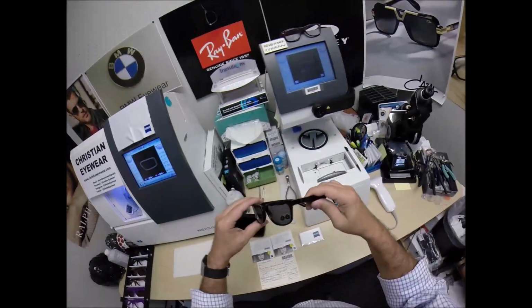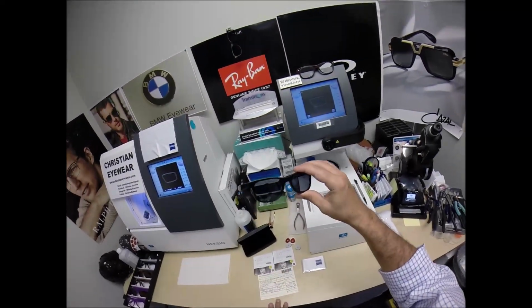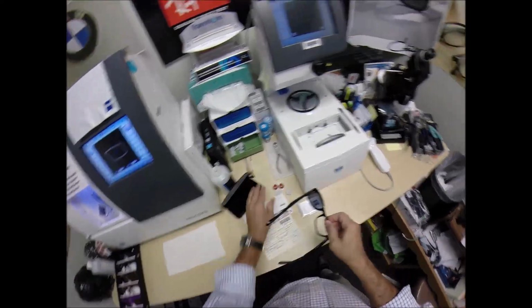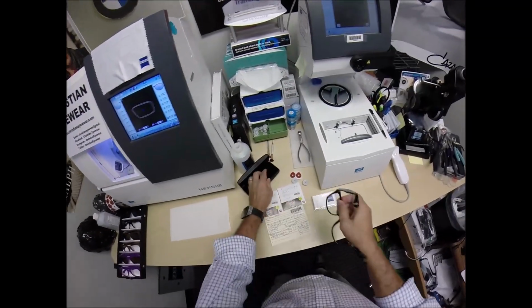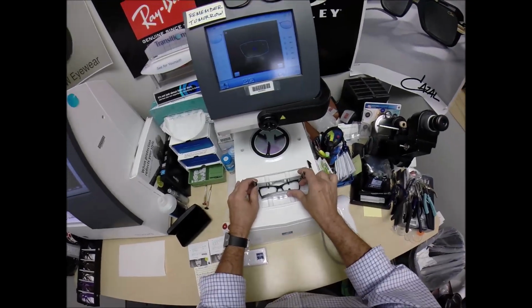I'll get to that in just a moment, but let me go ahead and begin cutting my lenses. Now these come as sunglasses, but I'm going to take out the dark lenses and put in my prescription lenses. Now I have transition, so when I go outside they'll turn dark, but while I'm inside they'll be light.